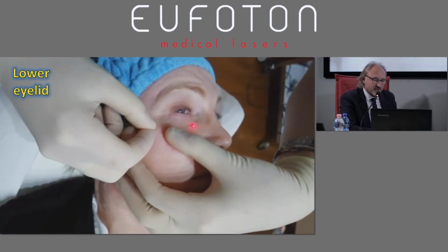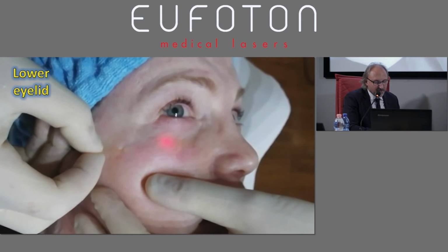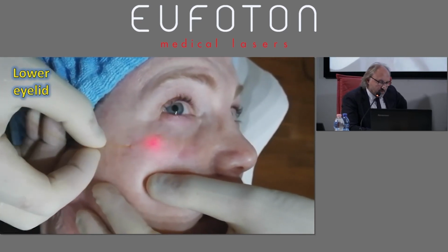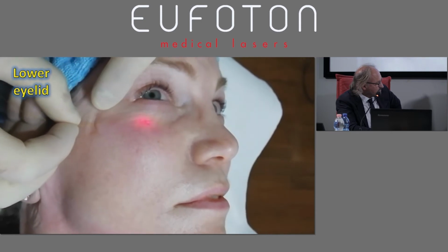So the concept is stimulating and not traumatizing. I use low frequency powers and T-on, 1.5 watts, 20-25 T-on.